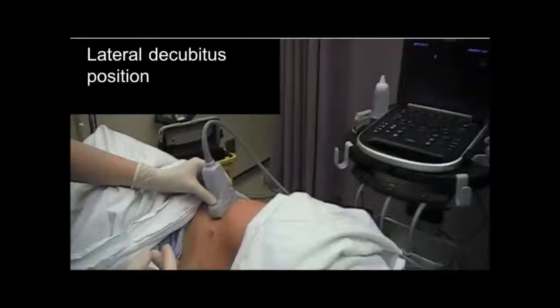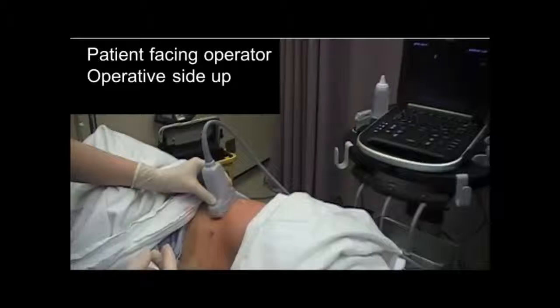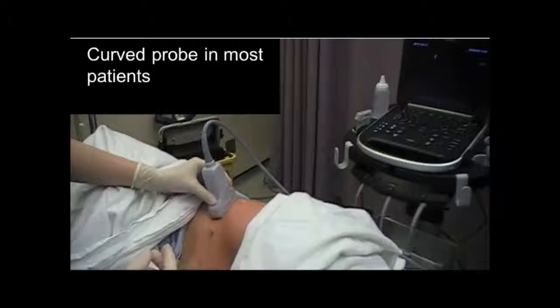It is recommended that the patient be placed in the lateral decubitus position. However, it is also possible to perform the block with the patient in a supine position. The patient is turned towards the operator with the operative side uppermost. The machine is placed on the opposite side of the bed. A curved probe is recommended in most patients unless they are very slim, as the wider field of view and better penetration facilitates recognition of the anatomy.